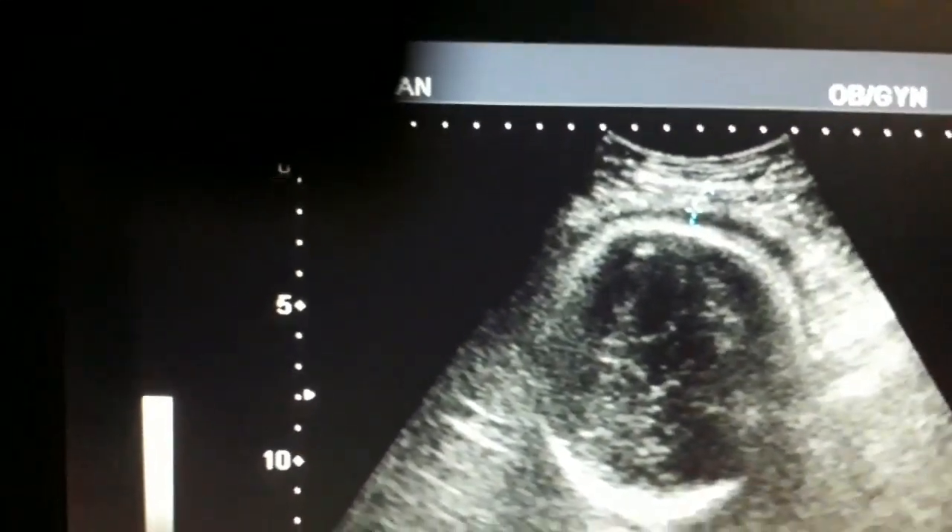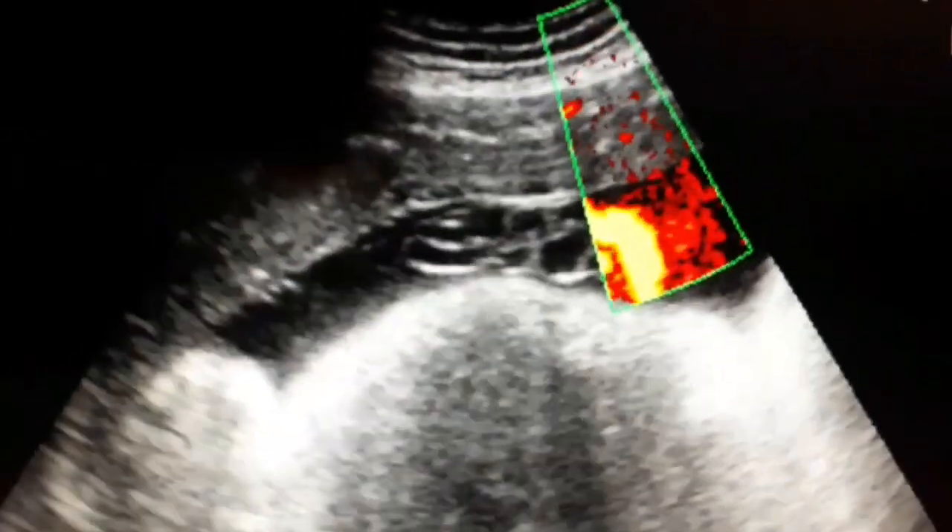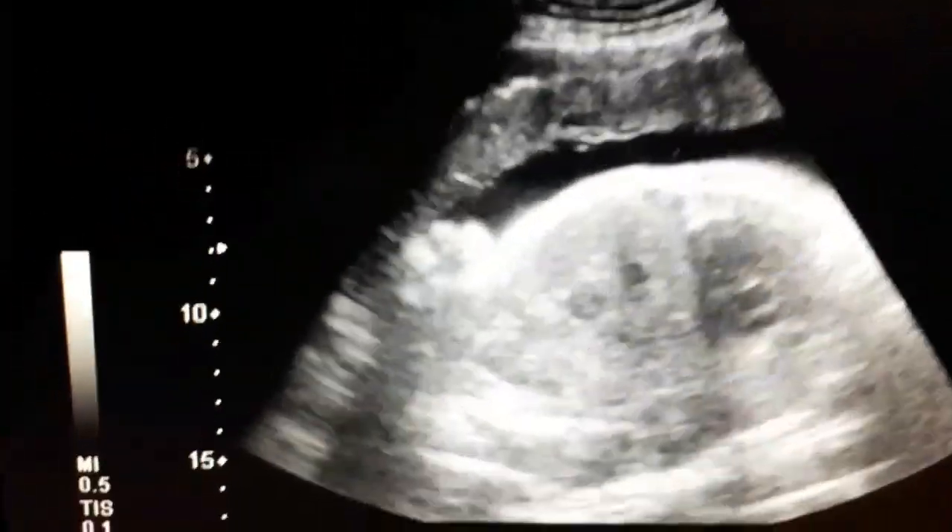The lower uterine segment thickness is very important in cases of previous surgeries. If it is less than 3 millimeters, that shows thinning out of the lower uterine segment and is an indication for C-section. Here you can appreciate the clear view of the grade 3 placenta and its lower end. You can also see the umbilical cord between the baby and the lower end of the placenta. I will put color Doppler on the umbilical artery to see blood flow, which differentiates it from other structures — if there is no color in the cord, it is not the umbilical cord.